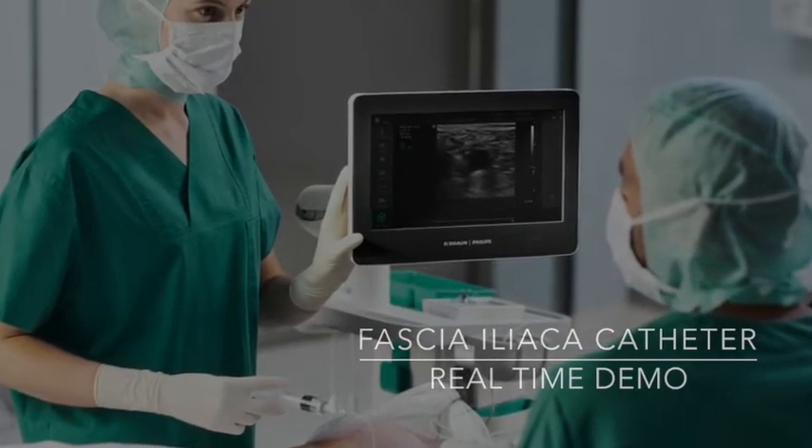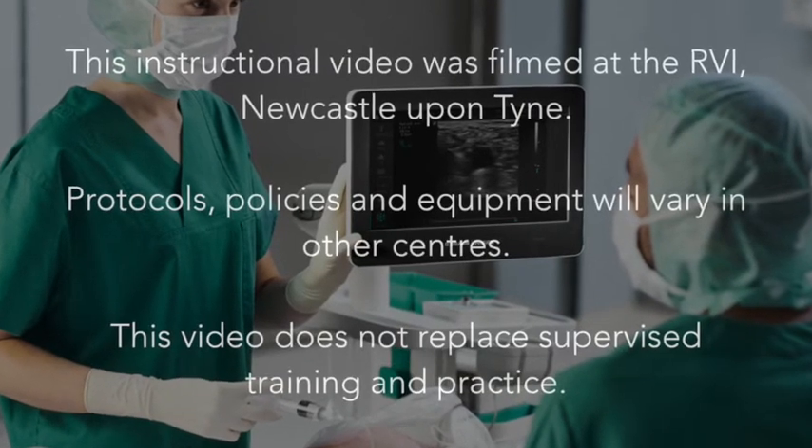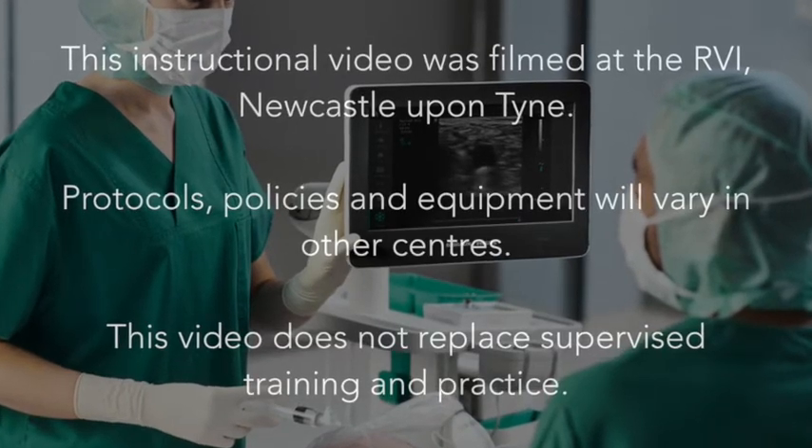Hello and welcome to this educational video on how to insert a suprainguinal fascia iliaca catheter.